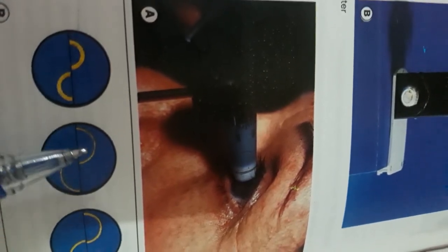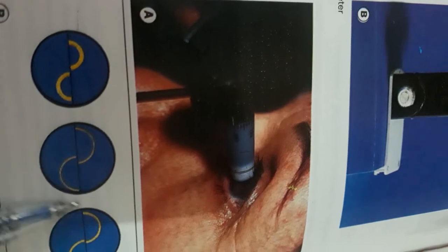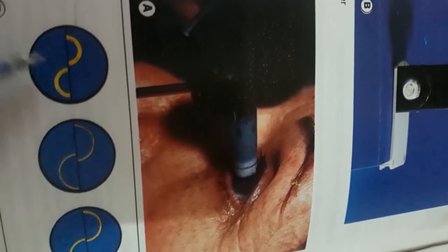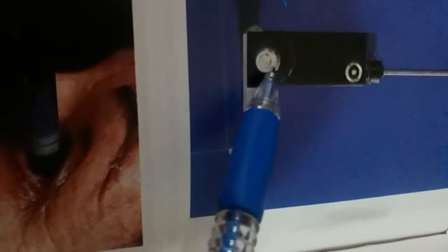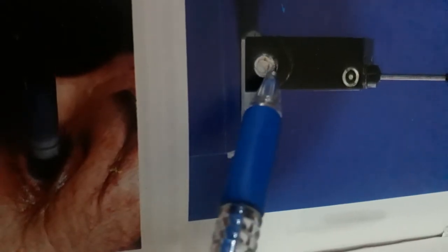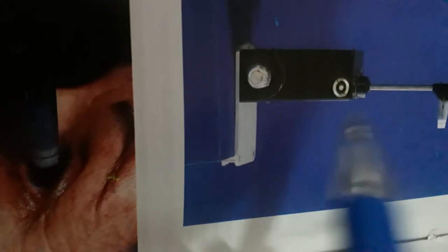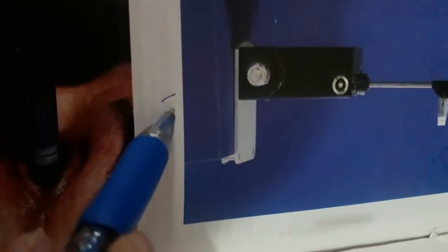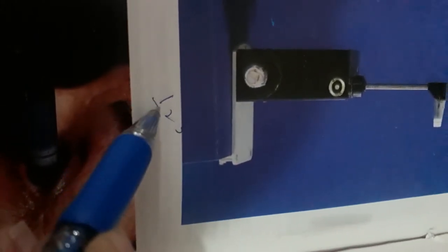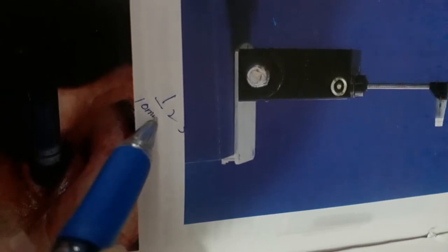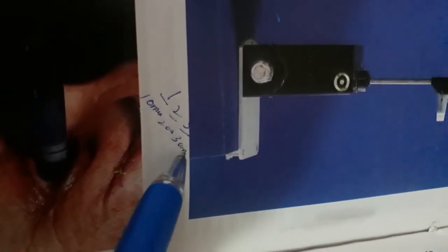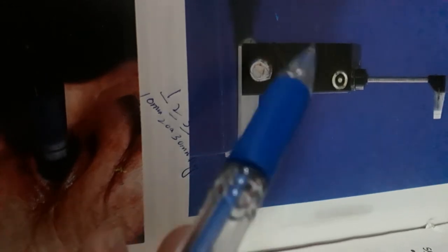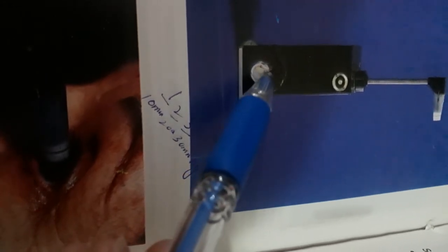Goldmann applanation has a dial with numbering 1, 2, 3. One means 10 millimeters Hg, two means 20 millimeters Hg, three means 30 millimeters Hg. We measure by moving the dial and observing the mires.